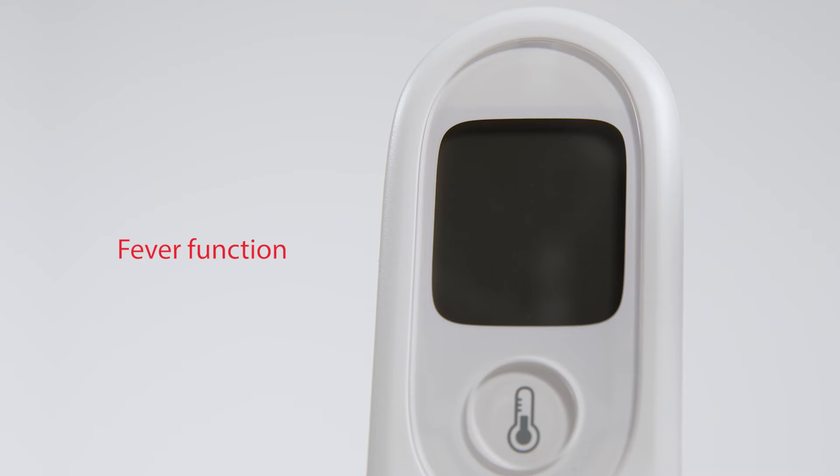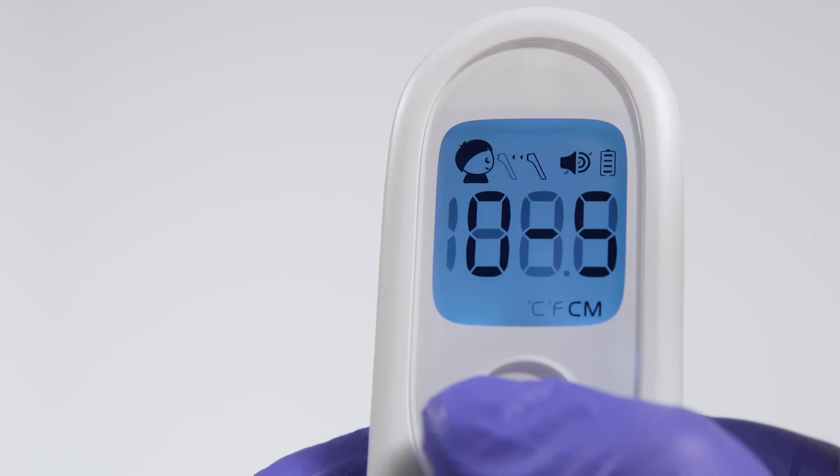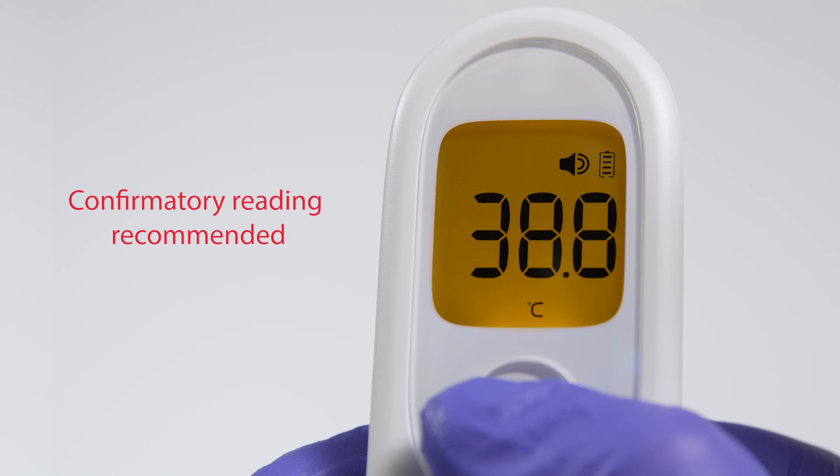Now let's explore the fever function. When a patient presents with a temperature that is considered a fever, the thermometer will sound a unique tone to alert the provider of a potential fever. In this case, taking a confirmatory reading is recommended.